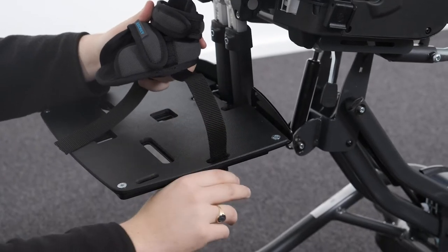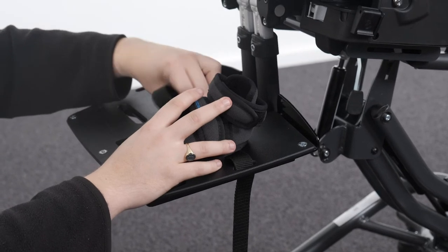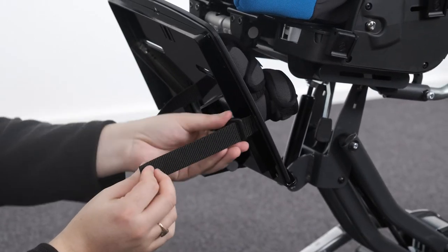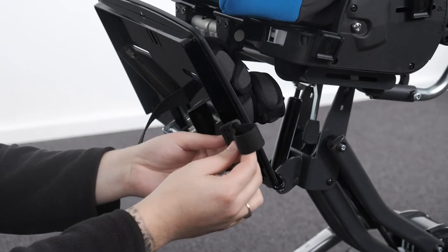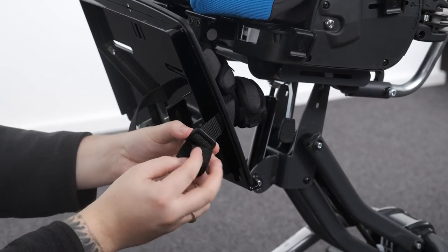Attaching the booties. To attach the booties, slide the webbing through the side slot in the foot plate. Loop the webbing back up and through the bottom and then top of the triglide. Finally, to lock the webbing in place, pass it through the bottom of the triglide again.